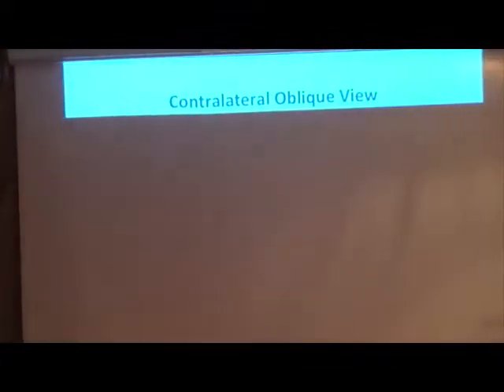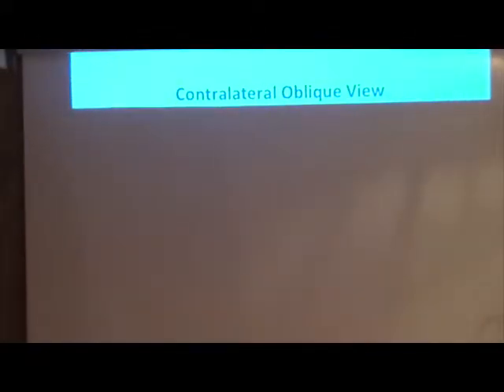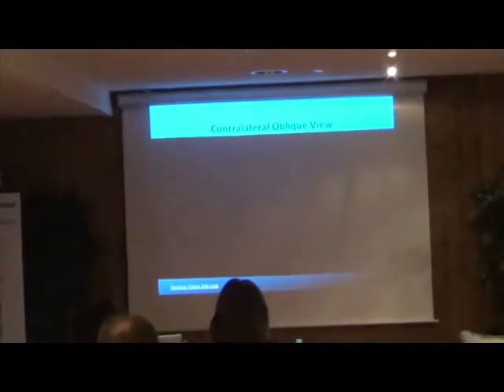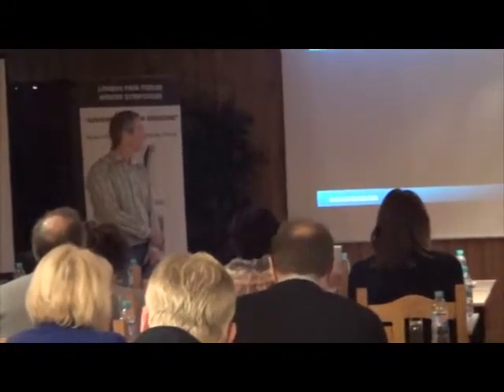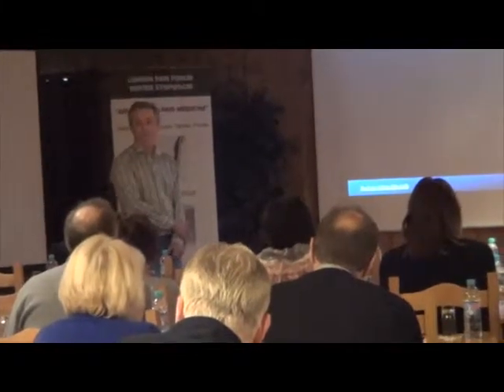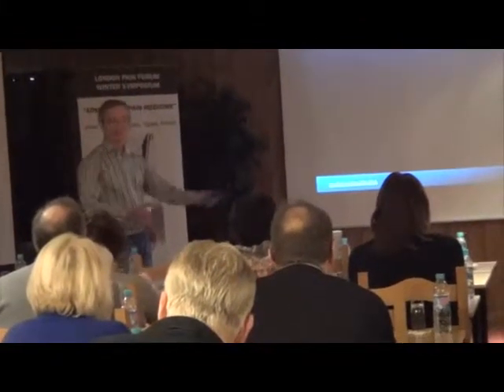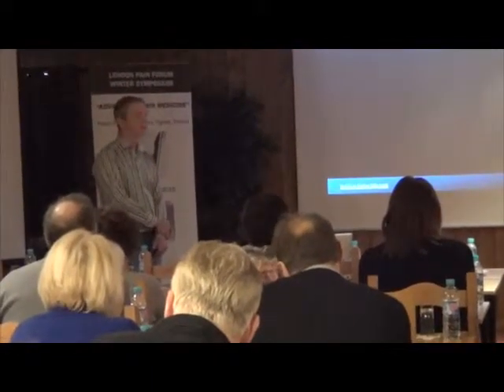Okay, some history. I presented this topic last year and I made this video. The idea of this video was to explain some difficult issues with the help of light and shadow. Fluoroscopy is very similar to light, and it goes through objects the same as light. And it's difficult to explain how different needle positioning in regard to the midline, and different fluoroscopy positions, like rotation along the needle, change the image on the screen.